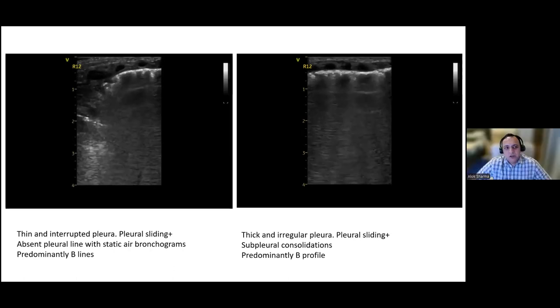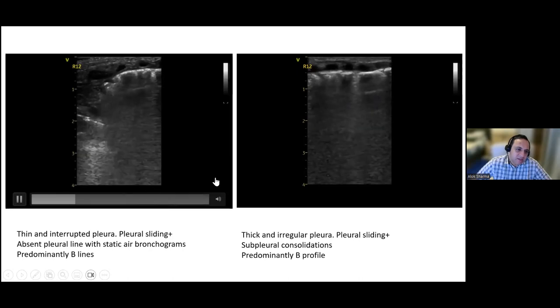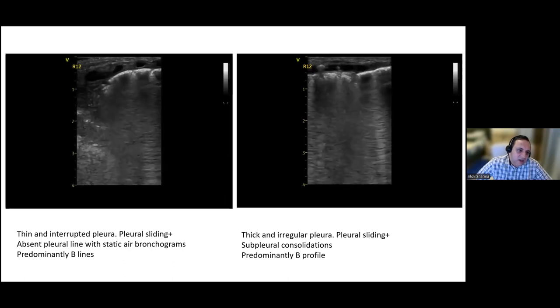Yeah. So just going back to R1, R2, Sujit, it's a beautiful image. Can I just, for teaching purposes, let the colleagues know? I do think that's atelectasis because the pleural margin is not established. It gives a very hyperdense kind of tissue sign.